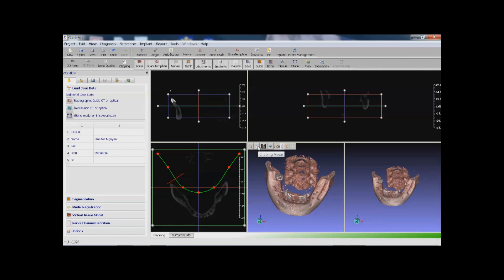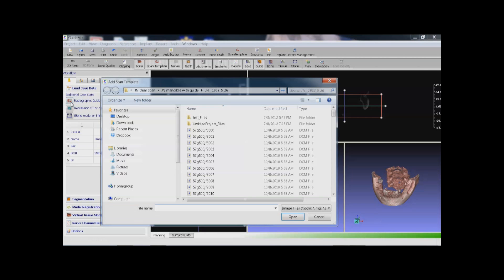In a production environment, however, we want to move to the next step right away. For this case, the second step is to load the radiographic guide.